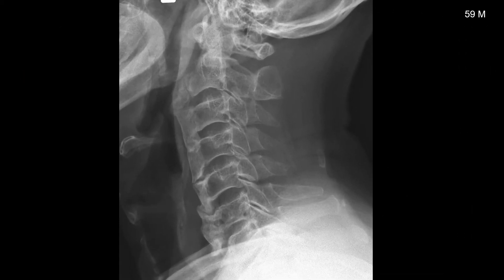Here is a 59-year-old male with classic DISH showing flowing hyperostosis of the anterior longitudinal ligament, relative preservation of the intervertebral disc heights, and lack of posterior element involvement.